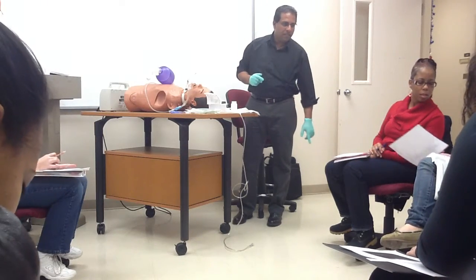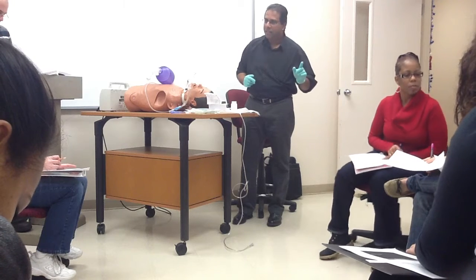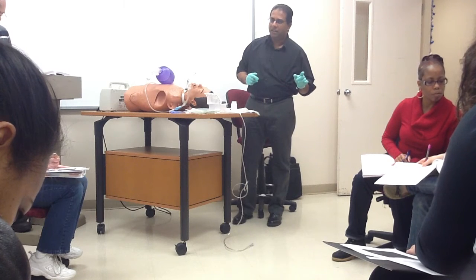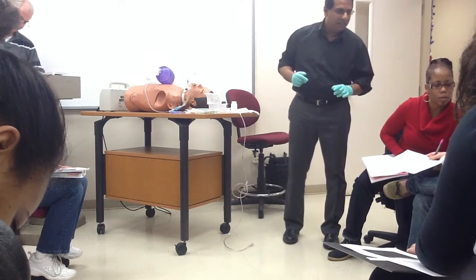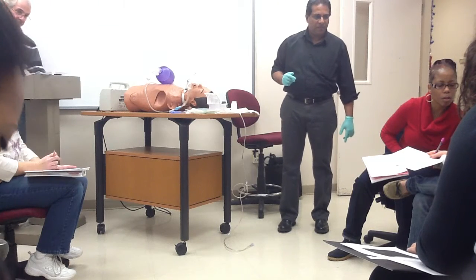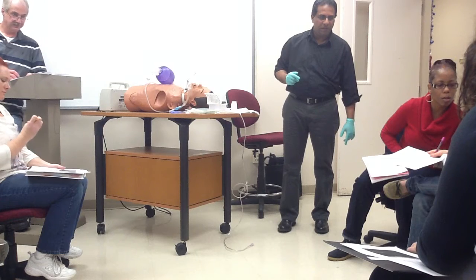Determine the size of the suction catheter to use. The outer diameter of the suction catheter should not exceed 1/2 the size of the inner diameter of the airway, because the airway is usually measured in millimeters, and suction catheters are usually measured in even number French size. A conversion is necessary. The following is the formula which will result.